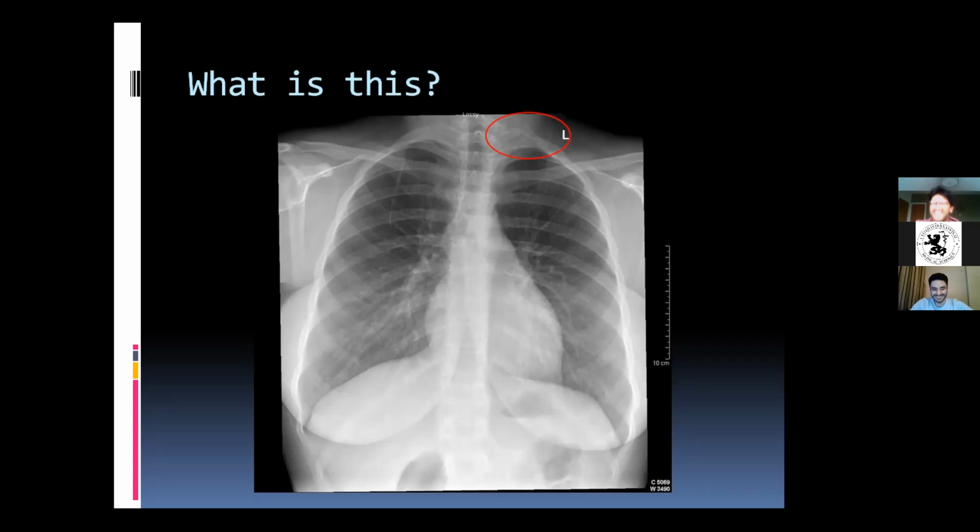They'll just come up on you out of nowhere and when you're least expecting it. Okay, so in this case, I had a patient. She was 38 years old, and she was complaining of intense pain, paresthesia, and weakness on her left upper limb.